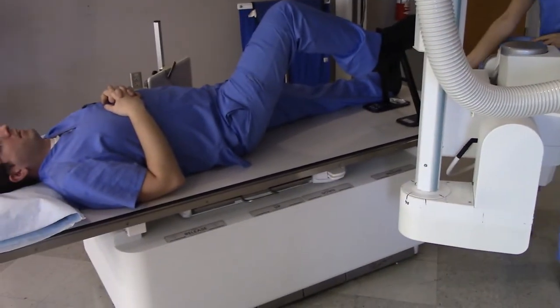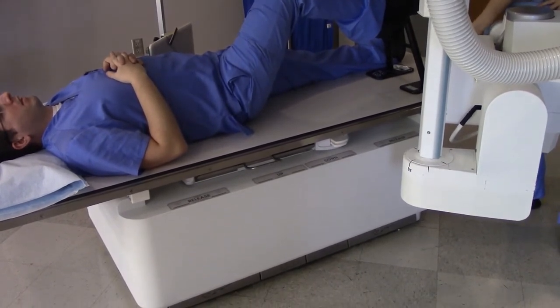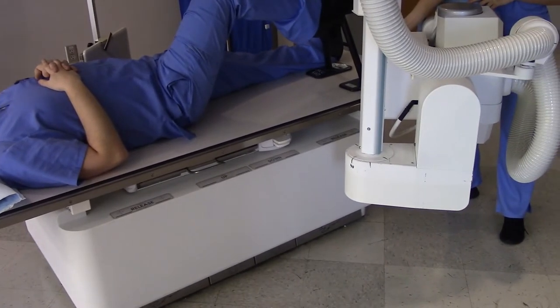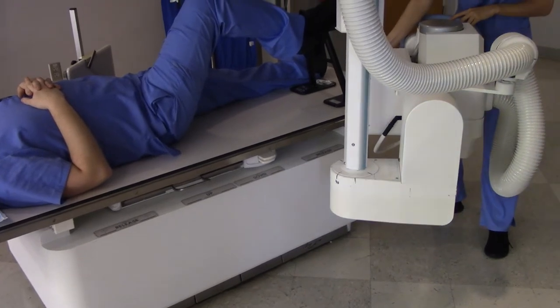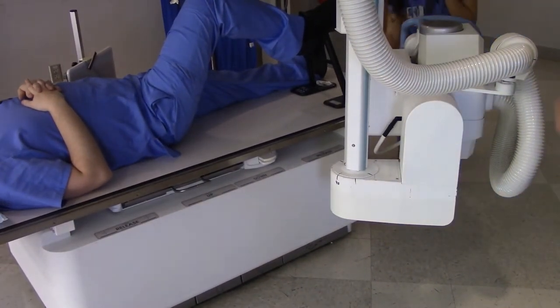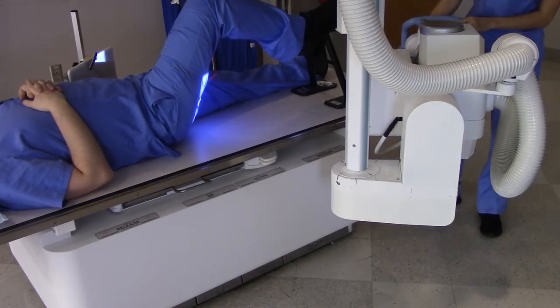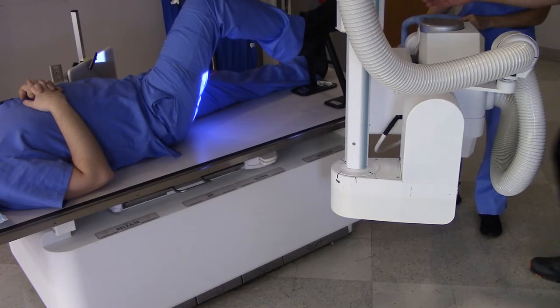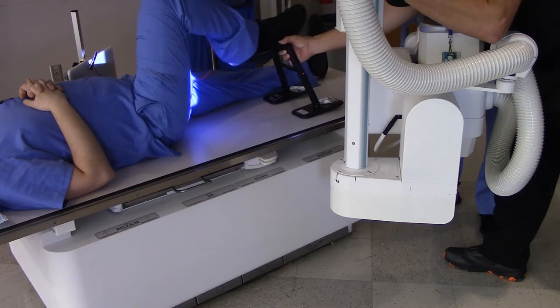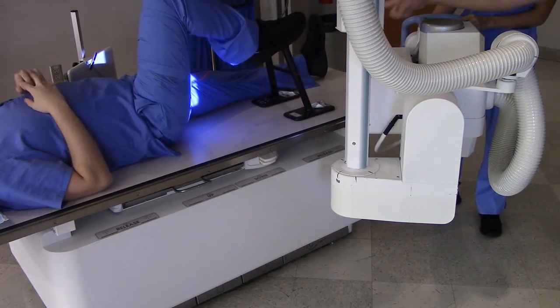Alright, very good. Turn on your collimator light and see where you are. It's not turned on — that might be over here. I'm pushing it. There it goes. Now maneuver your tube so that you're going to be shooting. I'm just going to get your leg to go back this way just a little bit more. Okay, there you go. Can you hold that position? I can. Alright, shoot right through that crease.